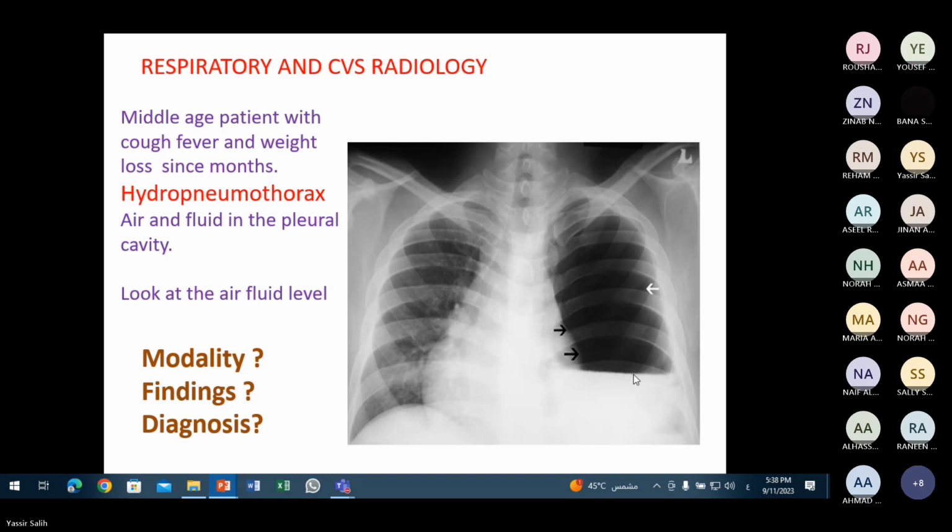Obliteration. Yes, there is obliteration, but notice that here there is a straight line. Lobar consolidation of a lobe. I mean, other words. You said there is air here. What is the material or composition of this area? What do you see in this area? Is it also air?